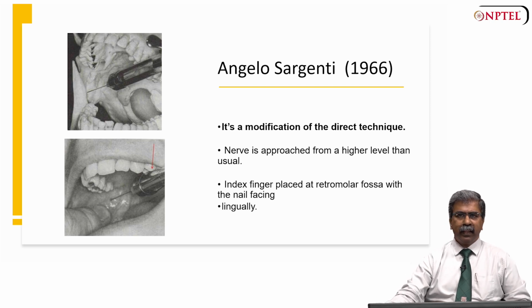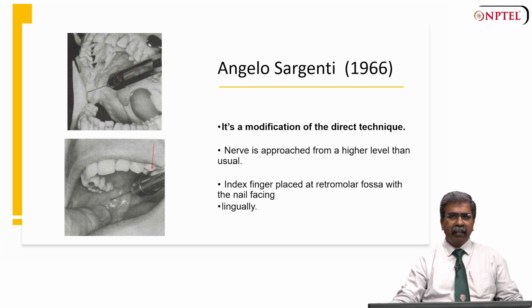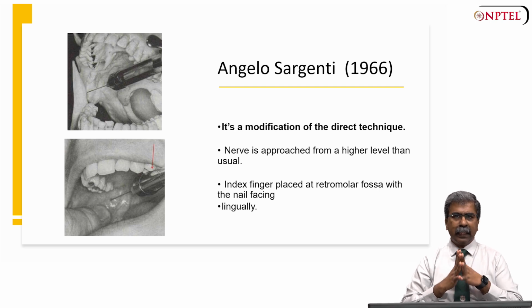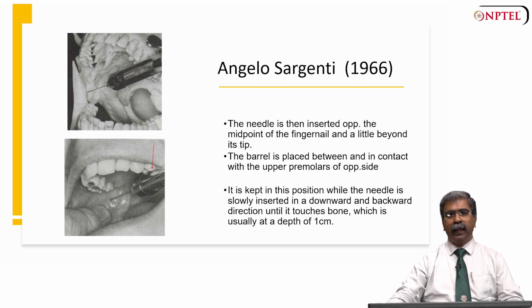And the index finger is positioned at the retromolar fossa with the nail facing lingually, helping to guide the needle for accurate injection and ensuring proper angulation during the injection. And this modified technique allows for effective anesthesia in areas that might otherwise be difficult to reach with a standard nerve block technique.